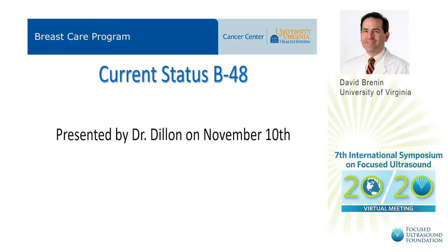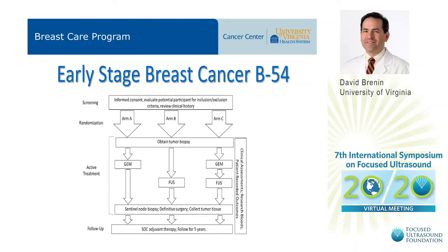The preliminary results from breast 48 were presented by Dr. Dillon at this meeting on November 10th. I'd encourage everybody to take a look at his presentation. So finally, we had experience treating patients with benign tumors in the breast with focused ultrasound, then patients with late-stage disease, and now it's time to start looking at patients with early-stage breast cancer.